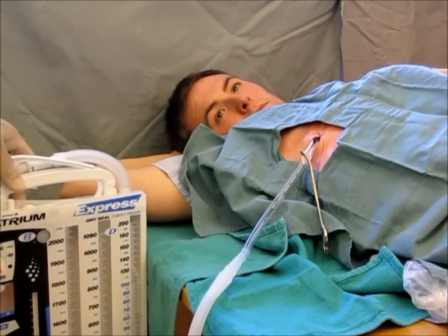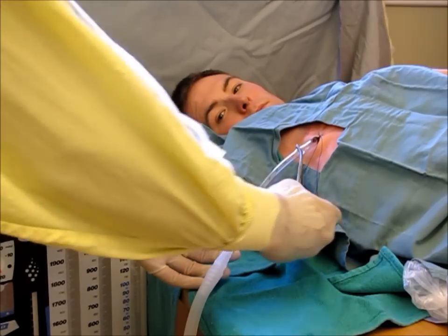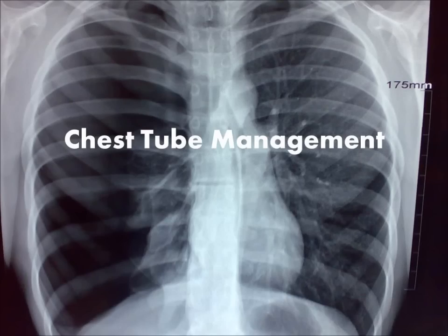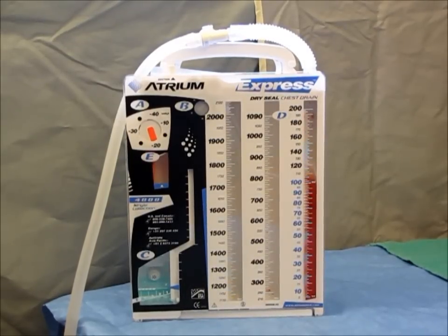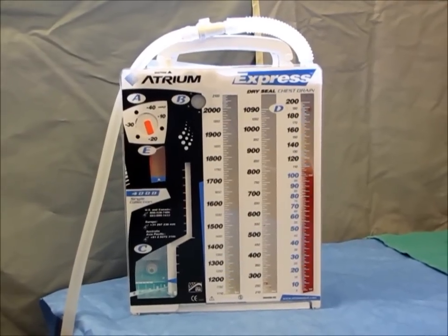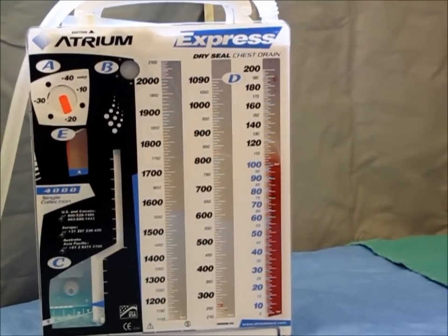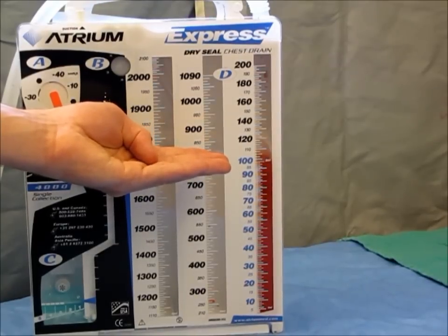The drainage system is now primed and you may release the Kelly clamp on the chest tube. Daily management of the chest tube involves a number of things. First is inspection of the wound to look for signs of infection or hematoma. Second is to chart the amount of fluid drained into the reservoir chamber of the drainage system — noted here, 100 cc's of serosanguinous fluid.